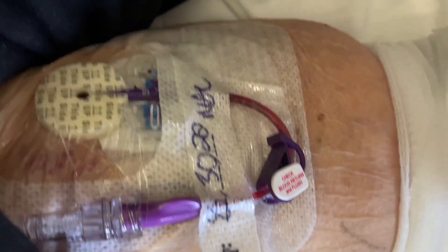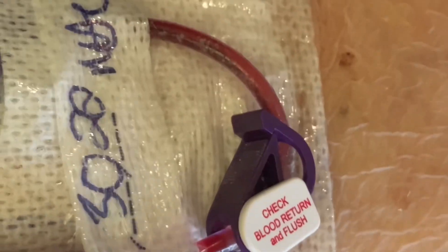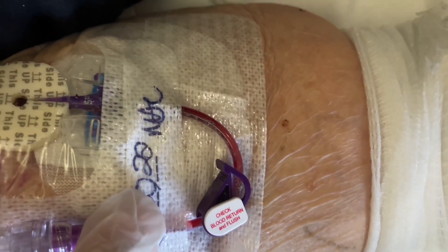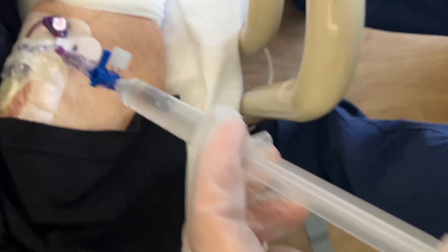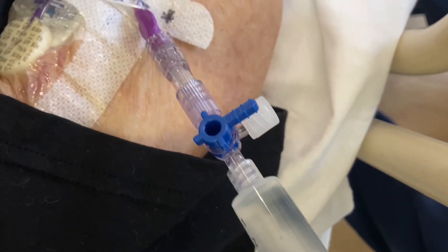Here we have a line clotted for who knows how long. Even though the dressing was changed, the line obviously has not been flushed for a very long time. This is extremely resistive — putting a good amount of force, and it's extremely resistive.